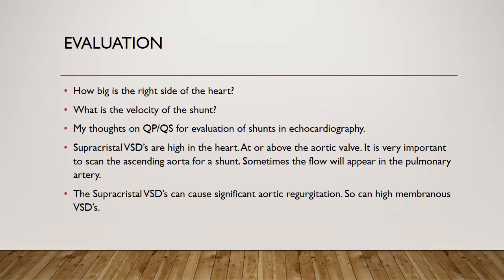For evaluation, ask: how big is the right side of the heart? That matters. What is the velocity of the shunt? The higher the velocity, the smaller the hole. The lower the velocity, the bigger the hole.